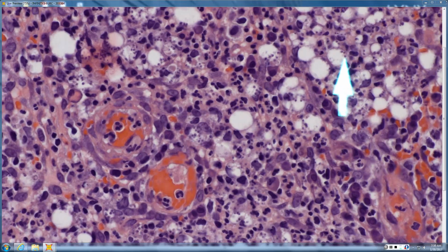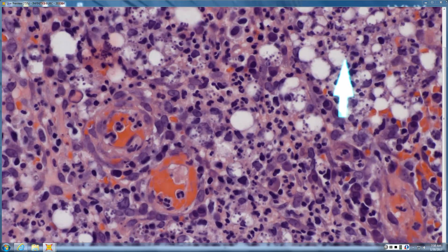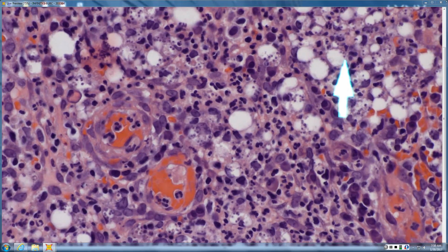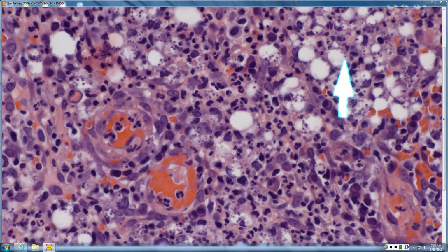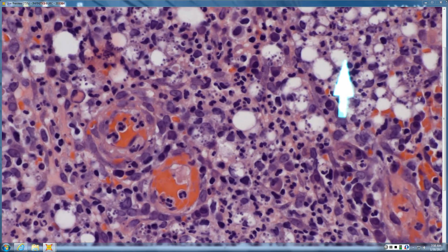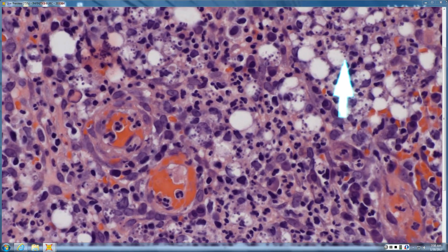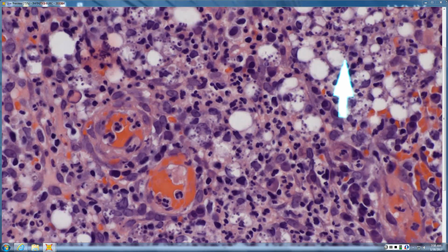What gives you dots at the periphery of the vacuoles? Is it histo that can do that? So histo, they're evenly spaced throughout. The one with the marquee sign where they're at the periphery, anyone? So that's leishmaniasis. Correct. So leishmaniasis, they are distinctly like bulbs on an old-fashioned movie marquee around the edge, or makeup mirror, or anything you can think of with bulbs around the outside, right?